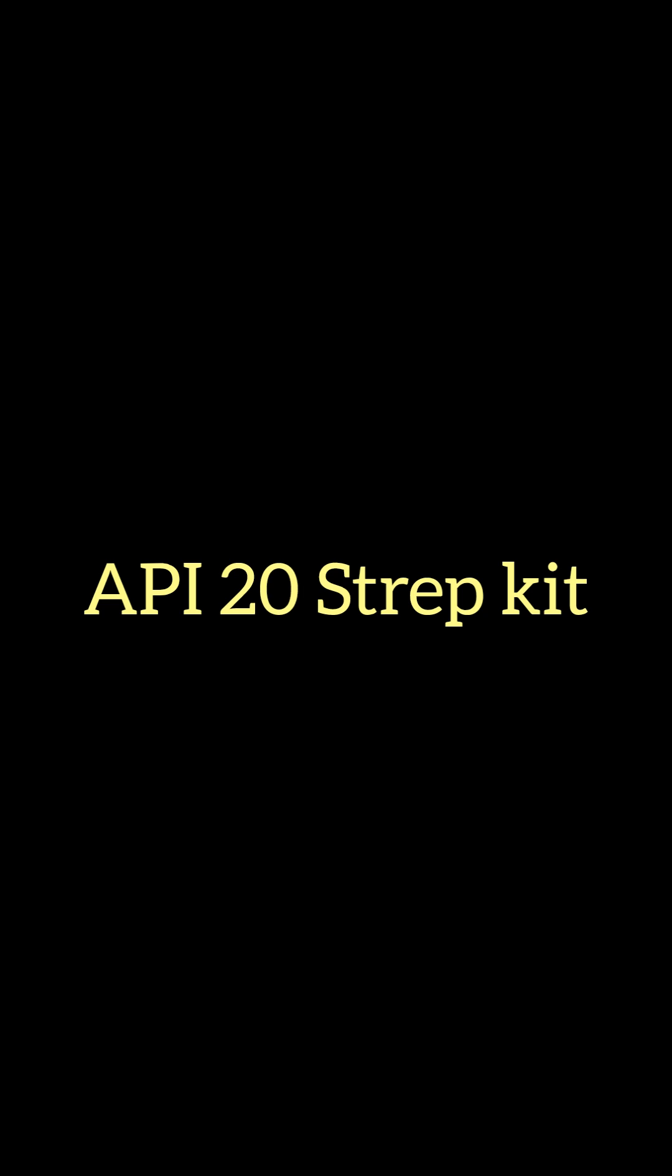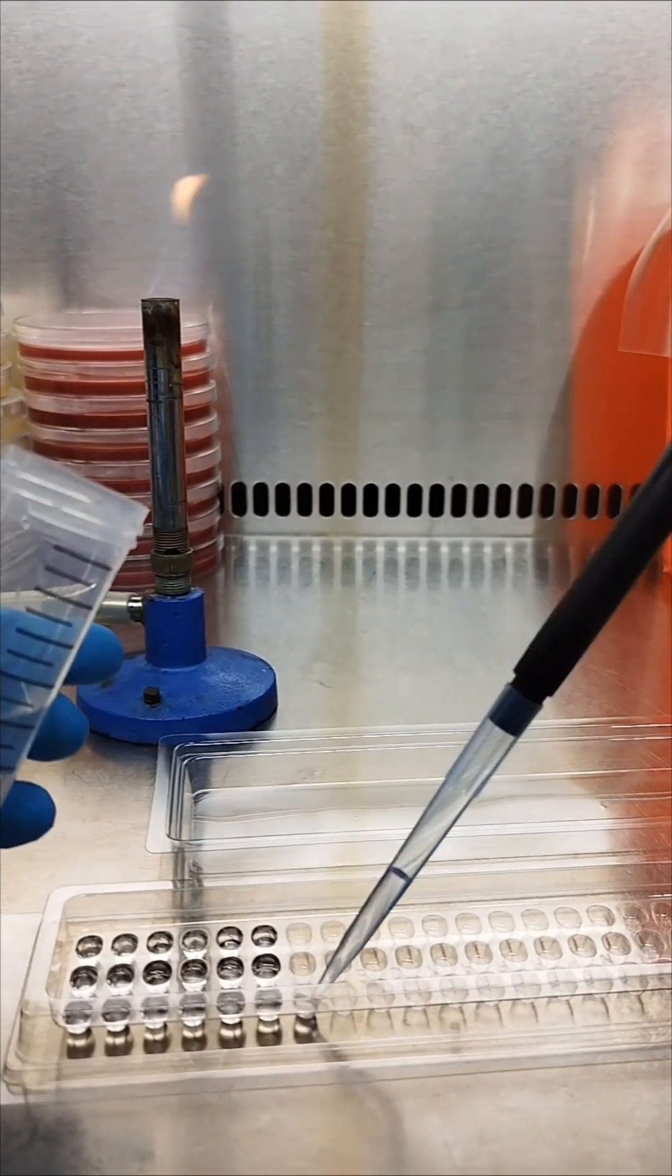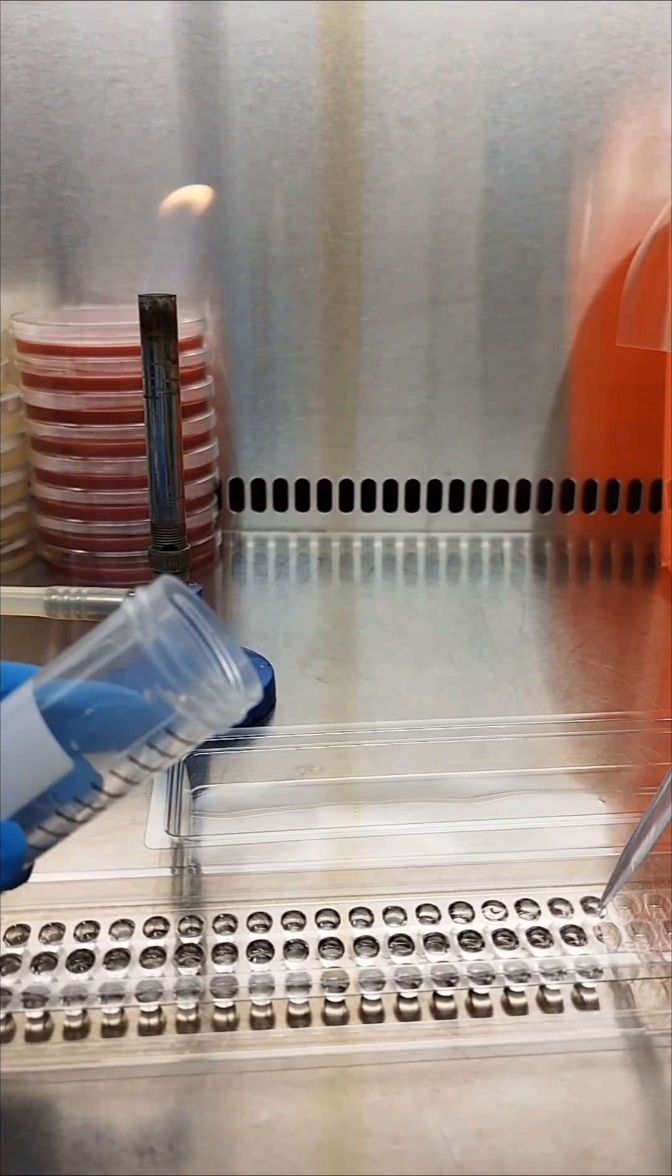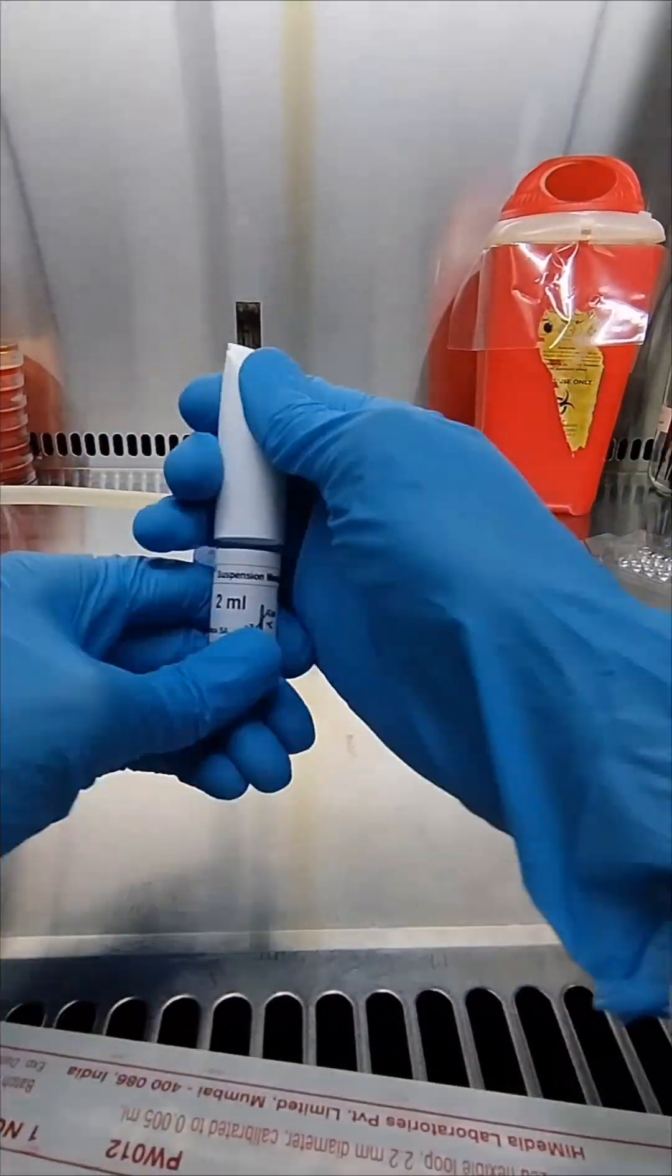This kit is used for identification of streptococcus and enterococcus. First, fill the incubation tray with the autoclaved distilled water so the strip does not dry out during the incubation.